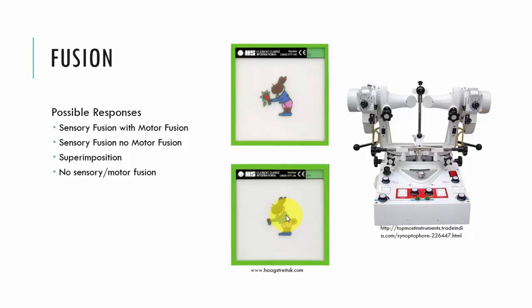That depicts sensory fusion. If they have motor fusion, when we attempt to converge the tubes and diverge the tubes, we'll note that the patient can maintain binocular single vision. They can maintain a single rabbit with the flowers and the tail through convergence and divergence whilst making a fusion convergence or divergence movement. And in that way, we'll actually measure the fusion range, the break and the recovery.